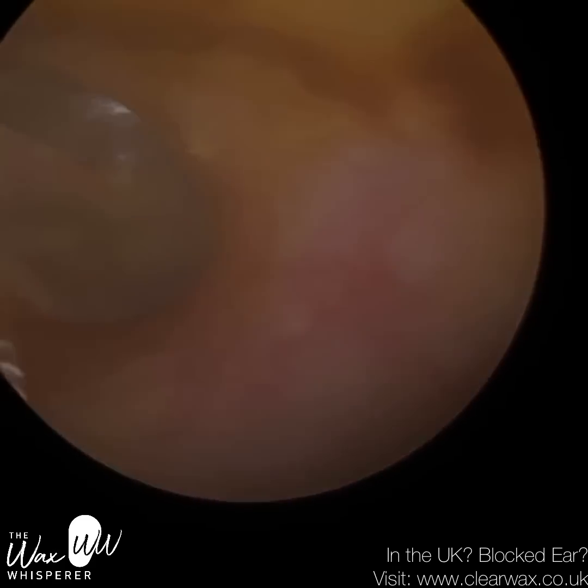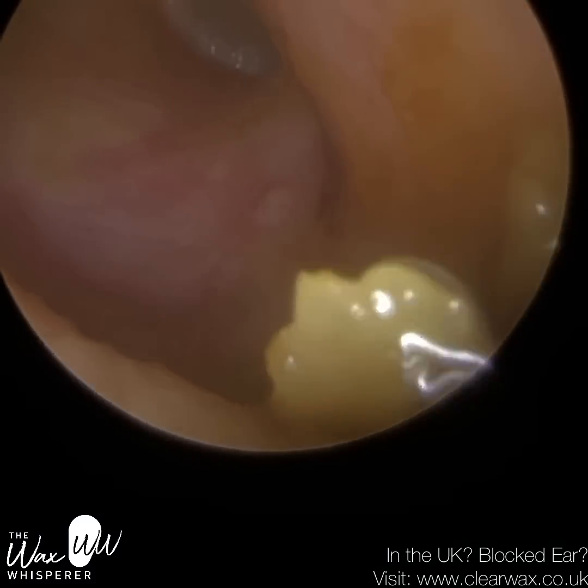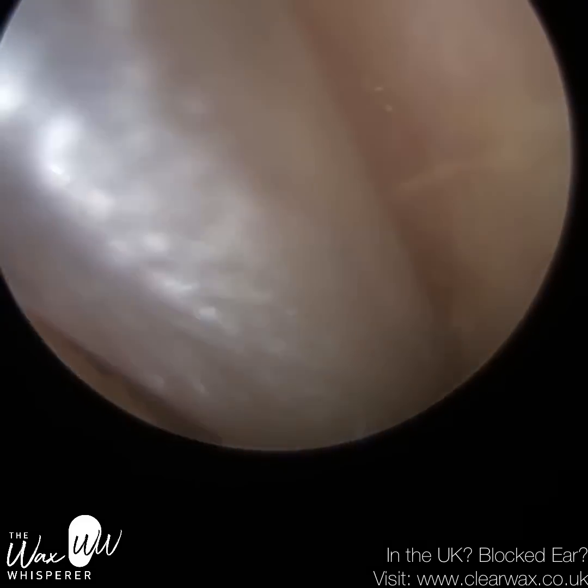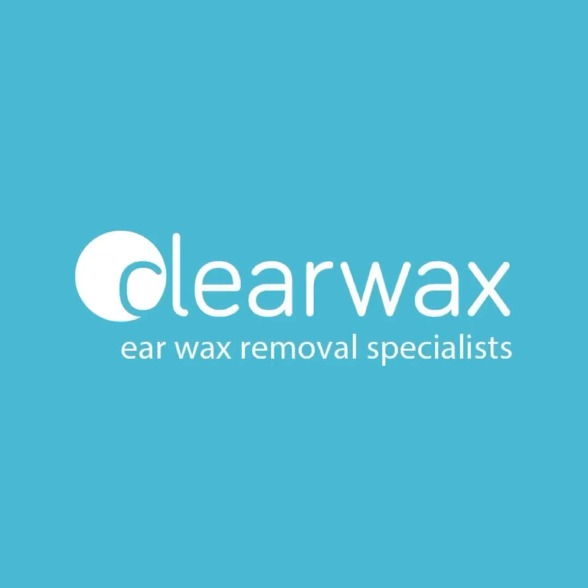So you can see, as I said, the eardrum is rotated anti-clockwise, or counterclockwise if it's in America, I believe. That's because of the way the patient is positioned compared to when I normally perform earwax removal.